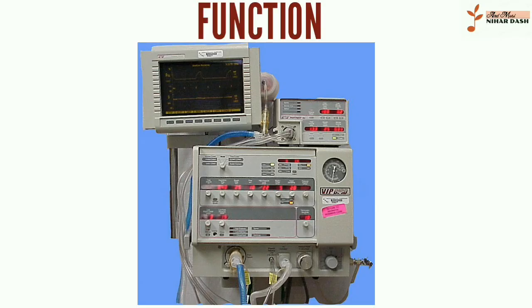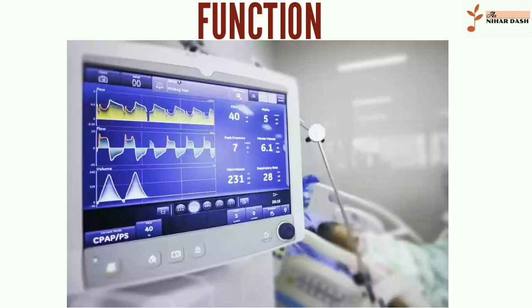Function: a standard setup for a ventilator in a hospital room. The ventilator pushes warm, moist air, or air with increased oxygen, to the patient. Exhaled air flows away from the patient. In its simplest form, a modern positive pressure ventilator consists of a compressible air reservoir or turbine, air and oxygen supplies, a set of valves and tubes, and a disposable or reusable patient circuit.